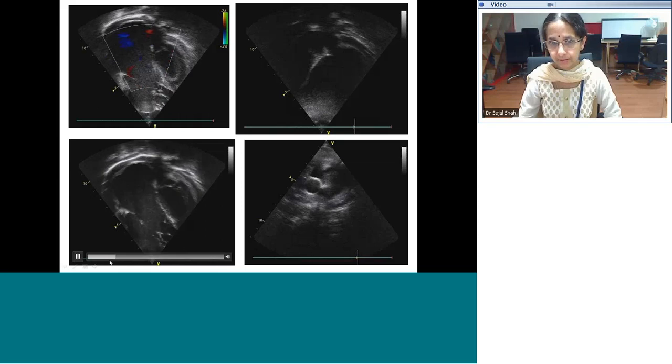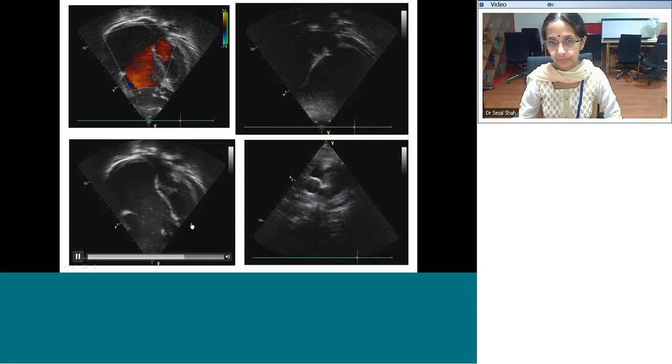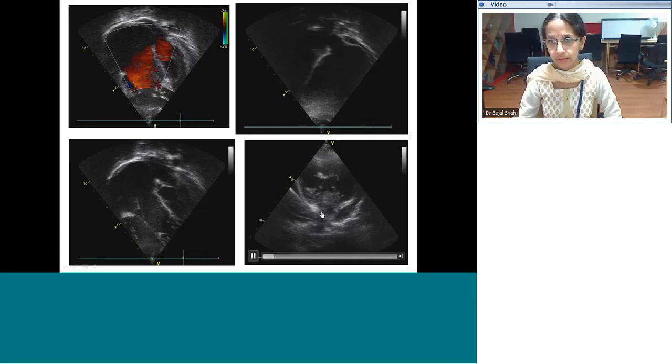See this? See, this area is the moderator band. Hugely dilated right heart. Yes. And can you see this small tissue? This is the STL. So it looks like it's quite in place. Let us see if you find it in this view. But this is more for showing the outflow tract. In this also I haven't. See this STL? See, the STL is quite in its place.